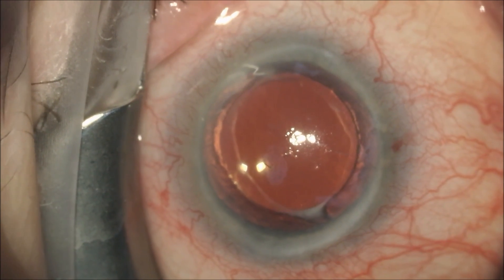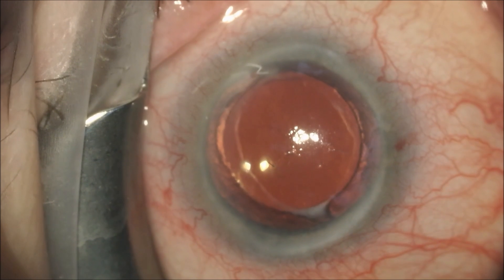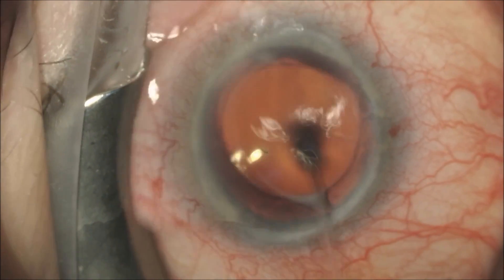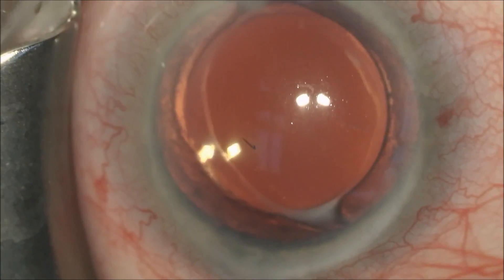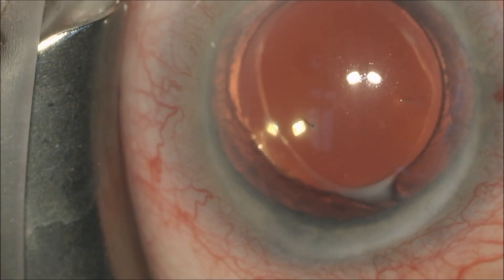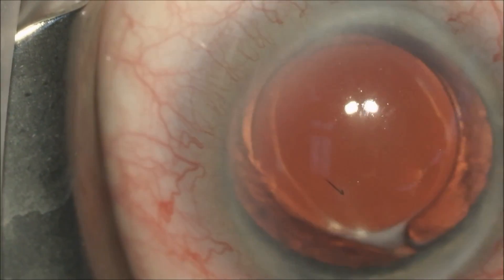You can see it with the barb in the clear cornea at the front of the eye. I've just irrigated the surface of the cornea with balanced salt solution. We will now zoom onto the cornea.